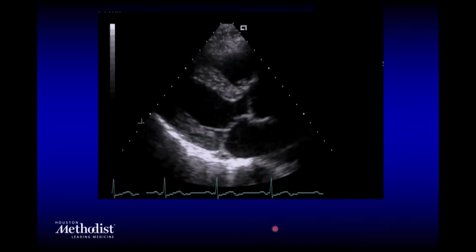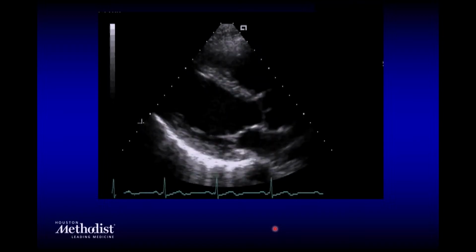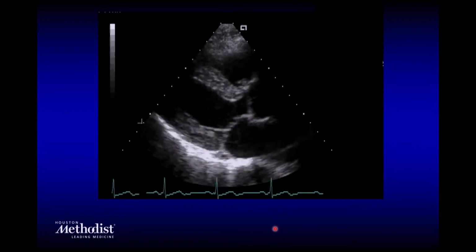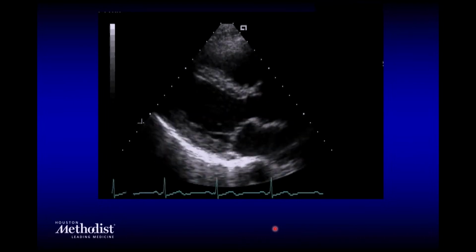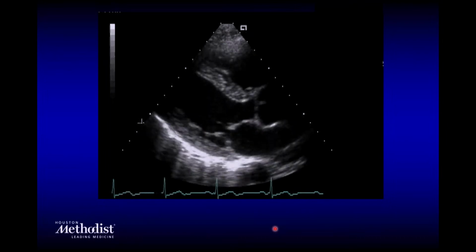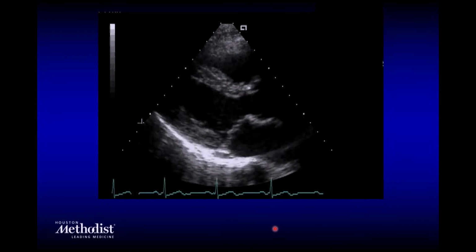How is 2D? Basically, it's an extrapolation of a single ice-pick view of the heart that you see by an M mode into a field of view. And it could be a sector for echocardiography. Why? Because it's built in a way for us to go between ribs, because if I go over the rib, I'm not going to be able to see much.